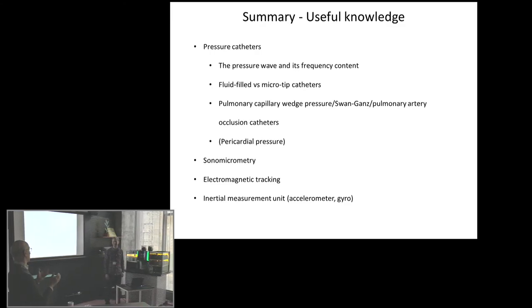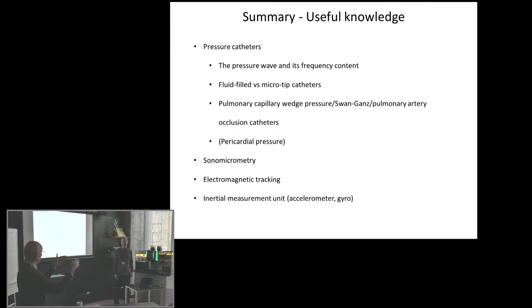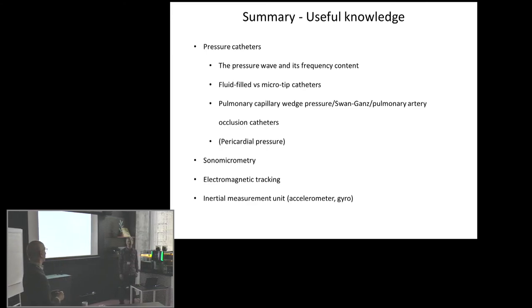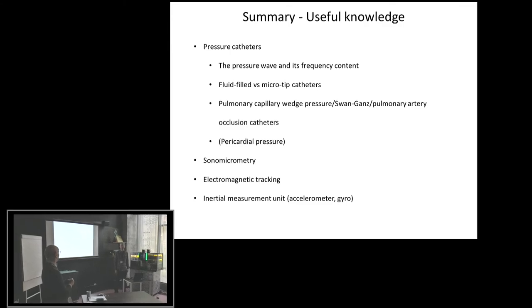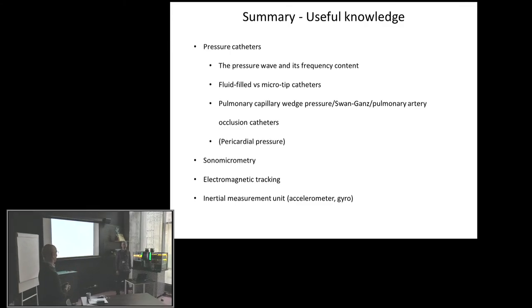But you can also imagine that you measure the wall motion. And actually, I know some people who want to put this one in the ventricle and then measure the electromechanics at the same time, in real time almost. But that application hasn't been developed by the company, but it's in those crystal signals that you showed. So that can be interesting.